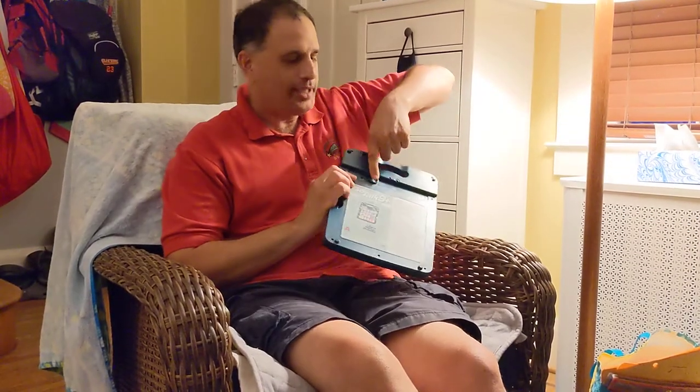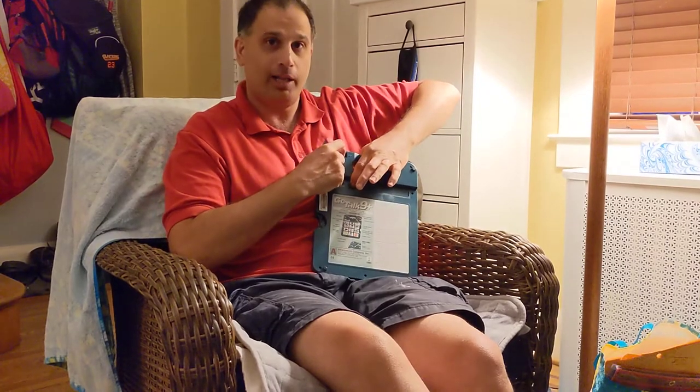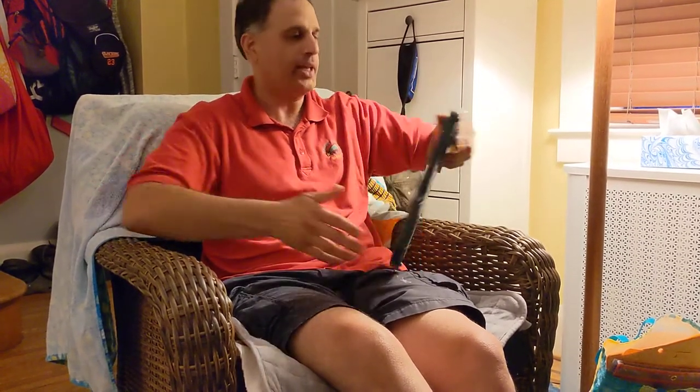So to unlock it, I'm going to turn the power off of the device. I'm going to hold down this record button on the back — hold it down — and I'm going to turn it back on while it's down. Turn it back on. Now I can let go. So now it should be unlocked, and it's ready to be programmed.